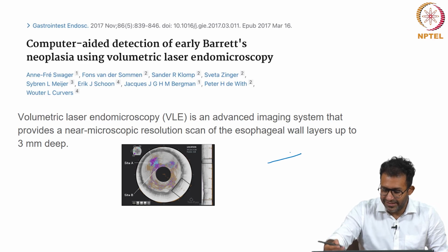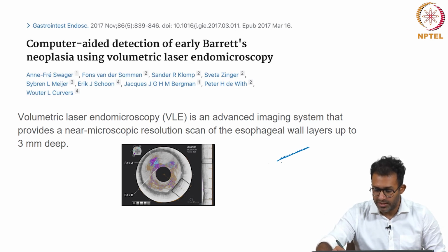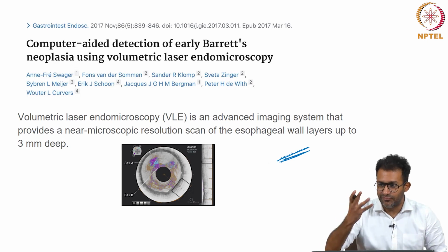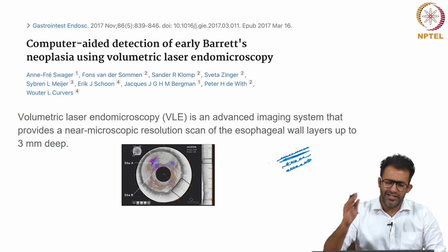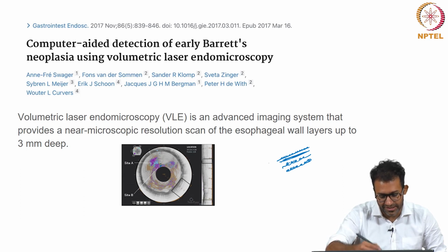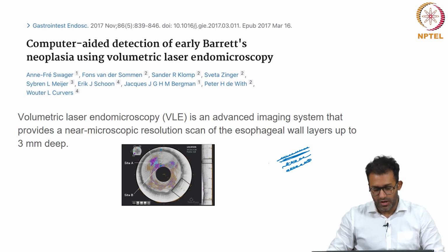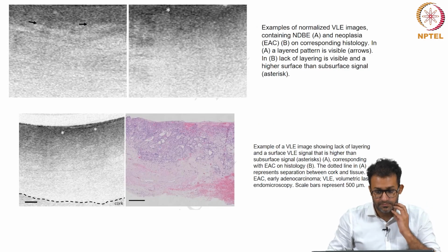The esophagus is divided into multiple layers. What you would see on endoscopy would be the mucosa. There is something called the submucosa. There are multiple lymphatics, lymph channels. There are muscle coats, muscle layers. Understanding this anatomy is very essential, and if you look at this, it helps you understand the layers. Here is the layer closest, these are layers which are deeper, and here you can see the muscle layer. So basically it provides an extremely high resolution of what you see in an endoscopy.